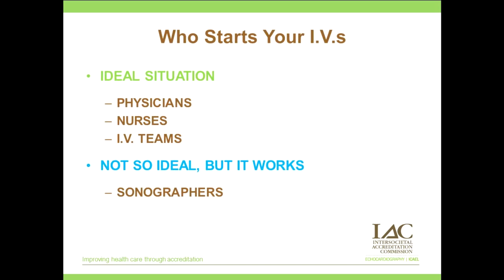We actually start IVs on all of our stress echoes, even if contrast isn't used, which it usually is, but all of our stress patients have IVs in them. These people are very, very proficient at starting IVs. In fact, they routinely have the IV in place and are gone from my room before I get the contrast product prepared. And as you know, it usually only takes about 2 minutes to prepare the contrast. Yes, this is an extremely efficient process, and I find myself very, very fortunate to have those personnel working with me.